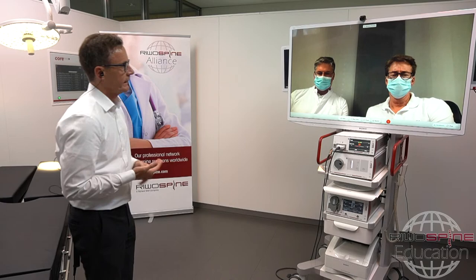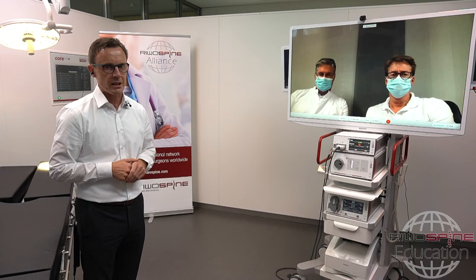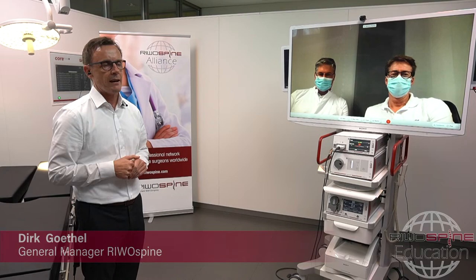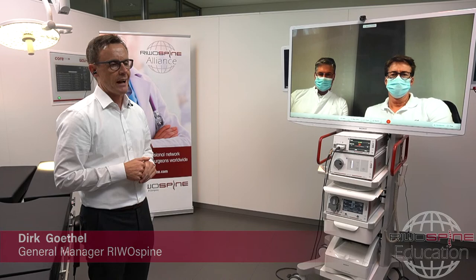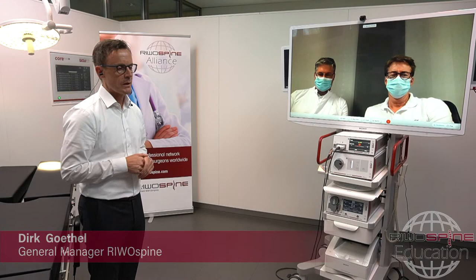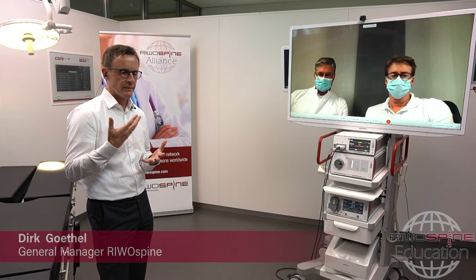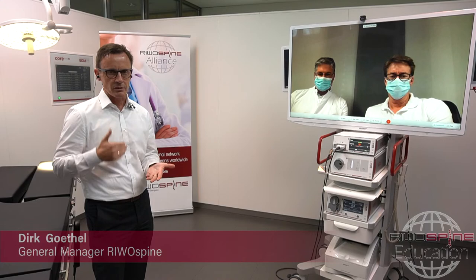I think probably I can answer that, because there are two possibilities how to manage this pressure inside the spinal canal. First of all, it's very important to use an endoscopic system which is designed so that you don't have too much inflow compared to your outflow. That means you should always have an open outflow for the endoscope, and the diameter of the space for the outflow should be much bigger than for the inflow. Then in general, you cannot increase this intraspinal pressure, even when you set up the pump to 80 or 100, because once you have more outflow than inflow and the system is not closed, then you only can reach the pressure of the water column when the water is coming out of the working channel or out of the outflow channel.